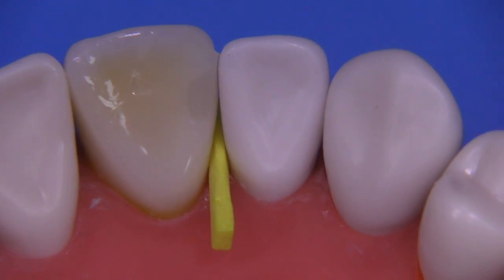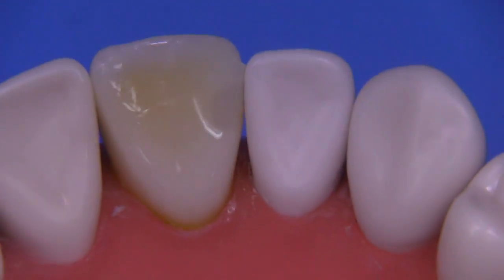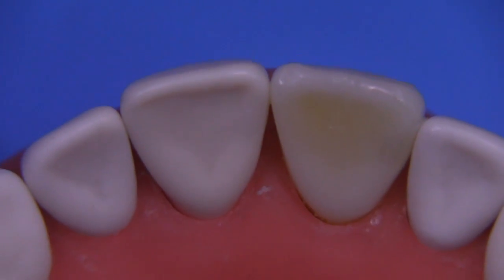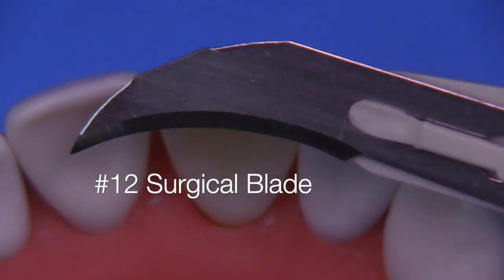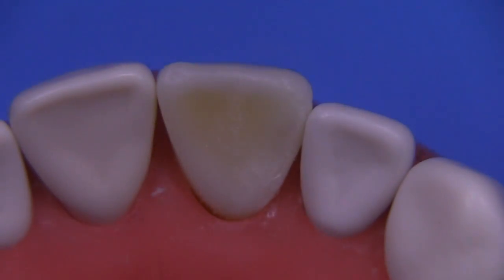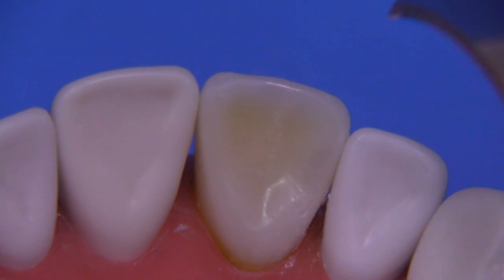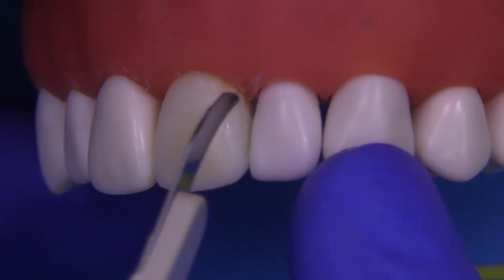There's lots of flash to clean up, but that is not a big deal if you understand how to remove the flash without the use of burrs. Never put a rotary diamond or carbide on this tooth — ever. You have to remember these teeth are fairly soft, they're brittle, and they'll make little marks with the burrs. So use a blade like a 12 scalpel and just use the tip. Don't use the whole side of it. Just use the tip and angle the blade at probably 30 or 45 degrees towards the tooth so that you're not scraping up along it, but actually turning the instrument in like this.